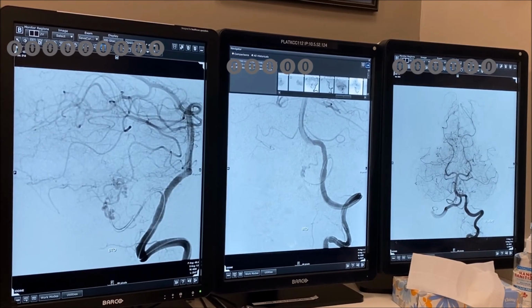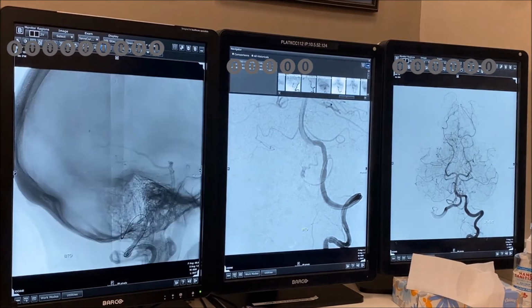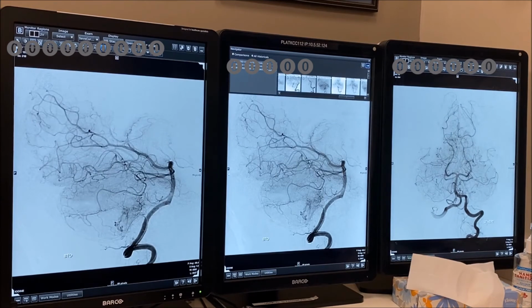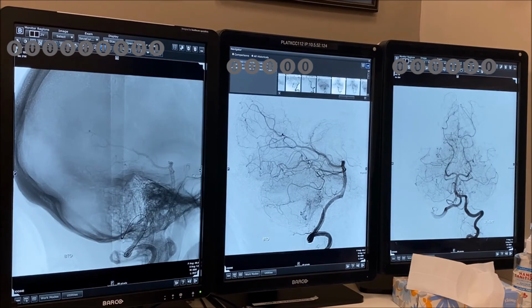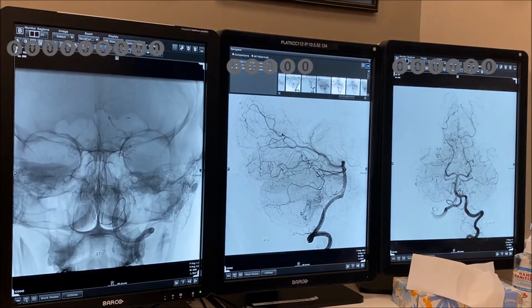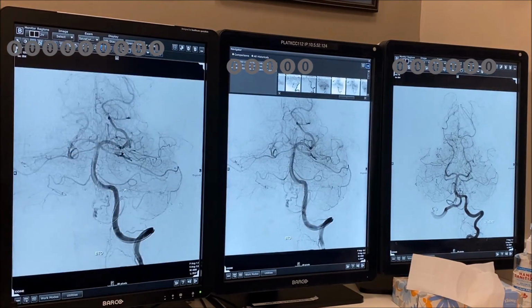So I think the next thing he did is to actually inflate the balloon. Let me see. No, the balloon is still not inflated. Maybe the balloon is inflated. Yeah, there is a bend, but it's still leaking. It's still leaking. So you have to slowly do this gently. Okay, so here's the balloon. Okay, so still not. Maybe injecting a little bit at the tip. I think there was one where the balloon was well inflated.